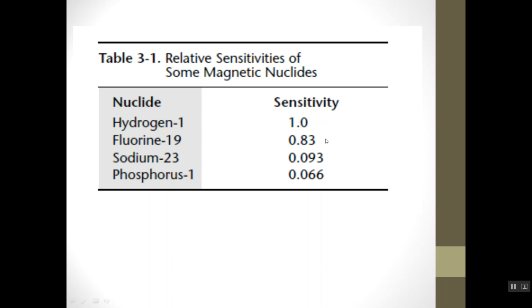Because if the protons are sensitive, I can use the external magnetic field to give energy, a radio frequency pulse, to move them from the relaxation state to the excited state. But in atoms which are not sensitive to the external magnetic field, I can't excite them. So the sensitivity of the protons inside the atom is a very important property.